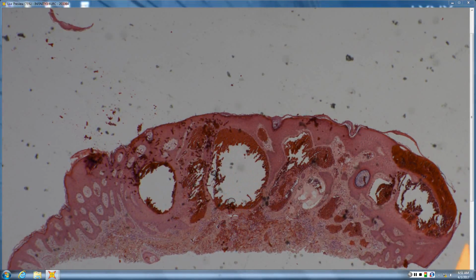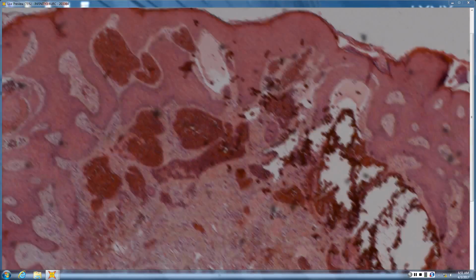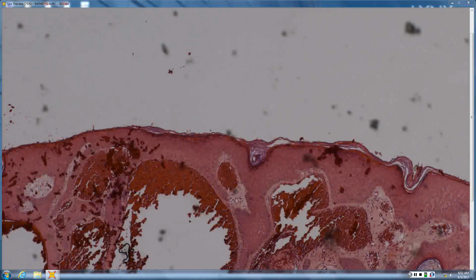Certainly this is a lot of red blood cells, and so that would hint at it being angiokeratoma and not a lymphangioma. But it's more this acanthosis, this seborrheic keratosis-like architecture, a little bit of hyperkeratosis on top. So it's kind of more of that really pushes it into a true angiokeratoma versus a lymphangioma. And there's some overlaps, but it does make a little bit of difference, as you guys know clinically, depending on the location and if you're, some syndrome like Fabry's or something, but that's really the big things that kind of help to delineate between angiokeratoma and lymphangioma.